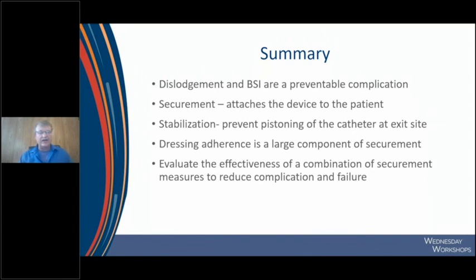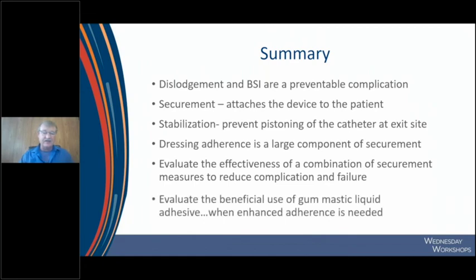And we want to look at combining technologies to maximize our ability to hold catheters in and prevent migration and dislodgement. And I can tell you from personal experience that using Mastic made a huge difference in the clinical experience that I've had. So that pretty much wraps up the dressing, and how to help secure and stabilize it. And I hope this was helpful for anybody that attended.